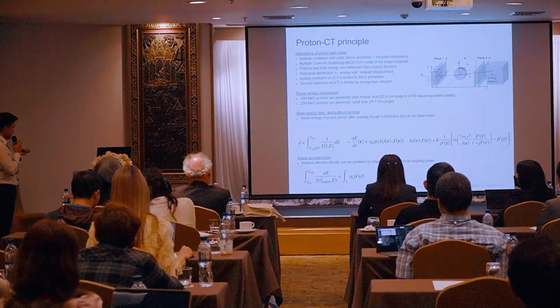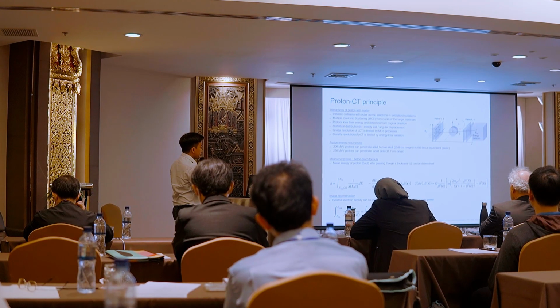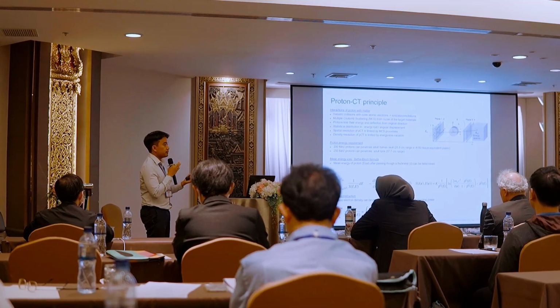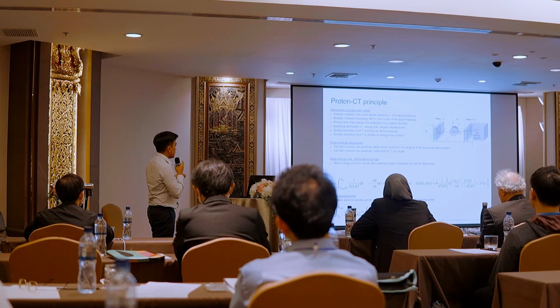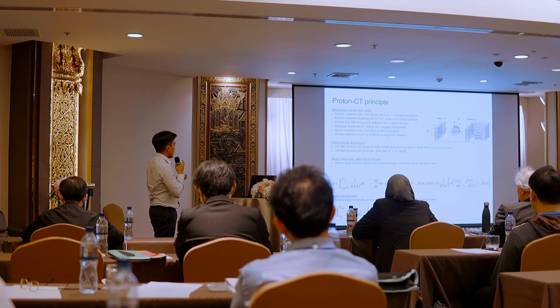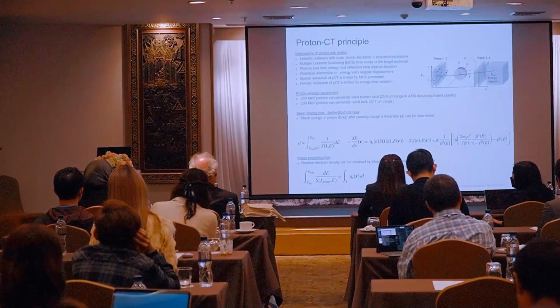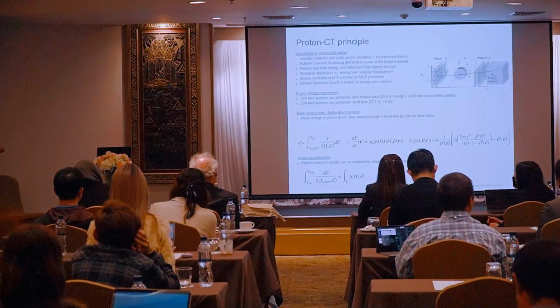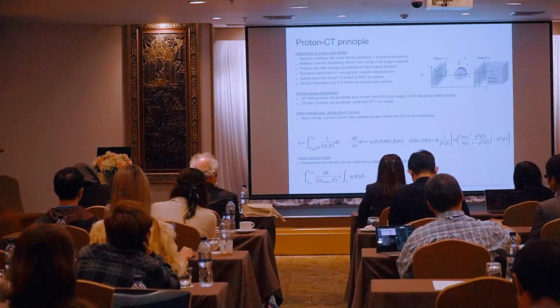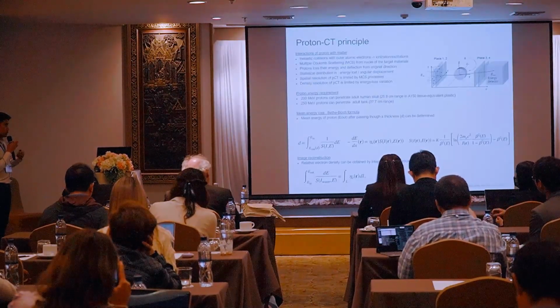Then, as I told you here, the requirement is more than 250, more than the 220 that we already have. One probably thinks about a booster for the Proton Center at KCMH that we are also trying to think about, but of course it's not easy, to boost the energy higher than 220 so that we are able to penetrate the adult trunk. Okay, and then here is the Bethe-Bloch formula, and finally, if you know the energy in and energy out, then we are able to get the electron density from this image. We hope we can do image reconstruction.